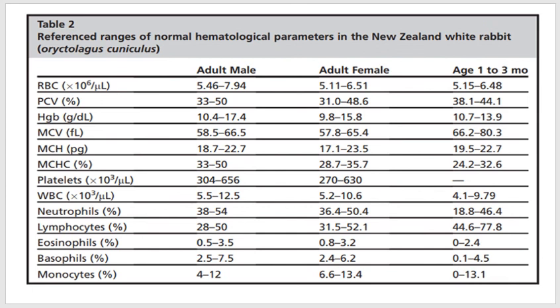Then next we have analysis for the amount and concentration of these blood cells in the blood sample that can be studied in this slide. You can observe it by yourself.